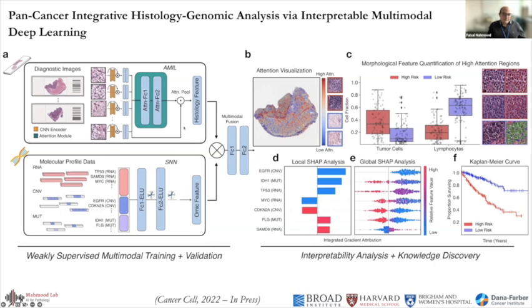So these are trained independently, followed by fully connected layers, trying to rank the patients, and then being able to plot something like this, where we can show how separable a cohort is. But the interesting aspect here is that we basically just feed in the whole slide image and the entire molecular profile. What does the model use from the whole slide image and the molecular profile? Can we quantify it to identify new markers? And can it go beyond what we already know about these cases? That's perhaps the more interesting aspect.